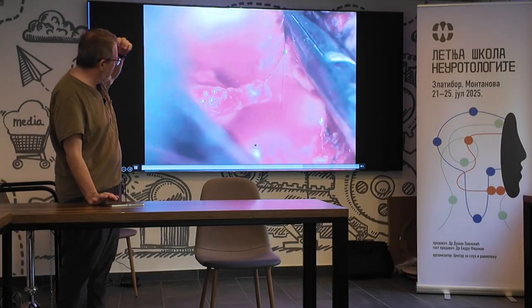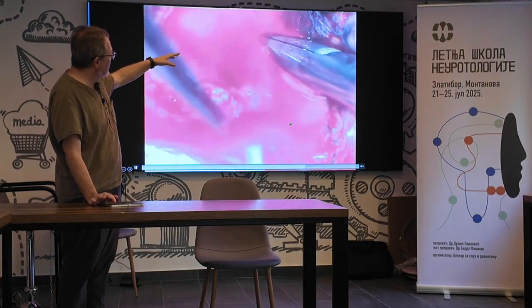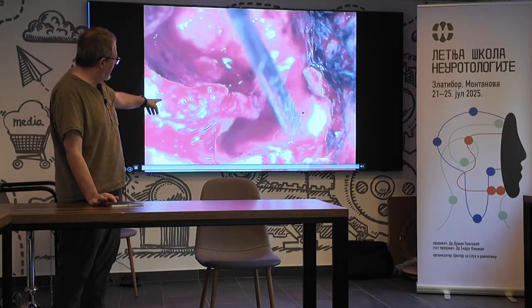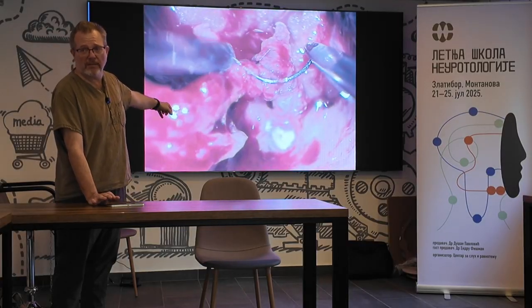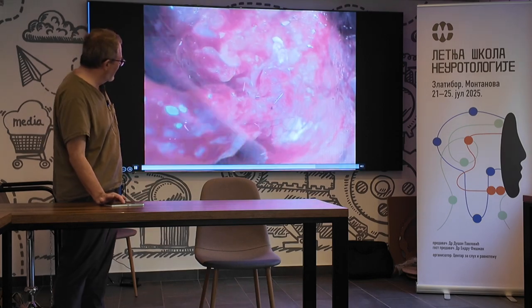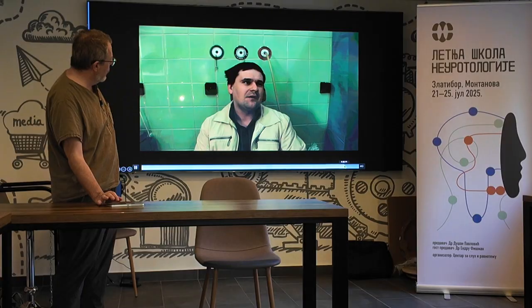This was actually done about 20 years ago in Poland, so you can see this is a PAL video system, standard definition. And this was the only nylon suture smaller than a 5-0 in the whole hospital. They found it in the urology department for suturing ureters. So we had 1 suture to work with for the whole thing. And we just put about 3 sutures. And just to show you what he looks like.